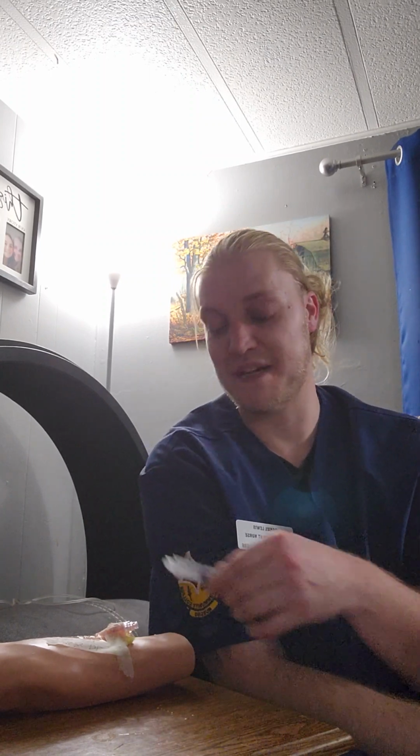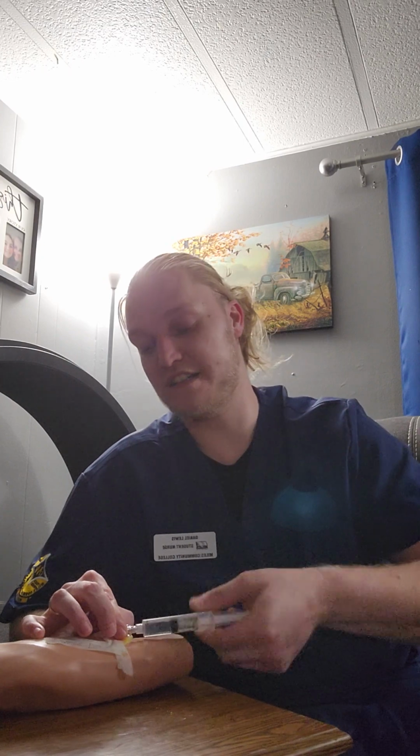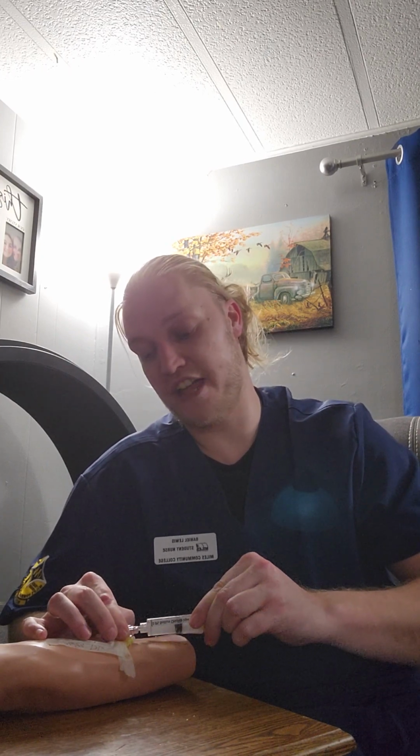All right, and I'm going to pause it, and then we're going to go ahead and do the last part, which is discontinuing an IV. So on that last part, I got a little messed up by the whole trying to do the medication. Anyway, after I would do the medication, I would go ahead and flush again with 5 milliliters of solution.